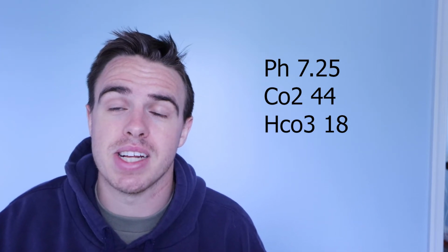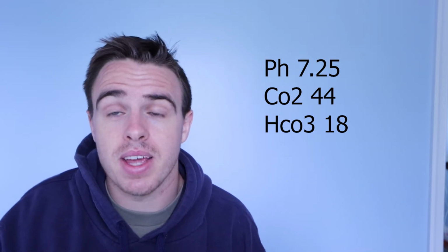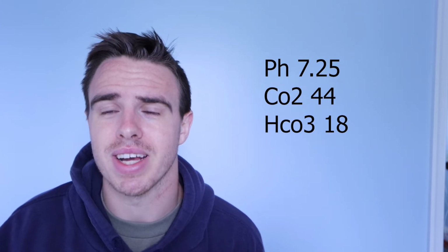Okay, so let's look at our CO2. Our CO2 is high. What is that going to do to our pH? It's going to bring it down, make it more acidic. Okay, that makes sense, that part there. But our bicarb isn't right, so let's look at this as well. Oh, well, our bicarb is low as well, so they're both causing it to be acidic. They're both going to bring the pH down.